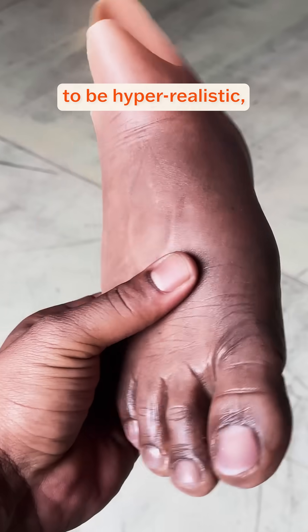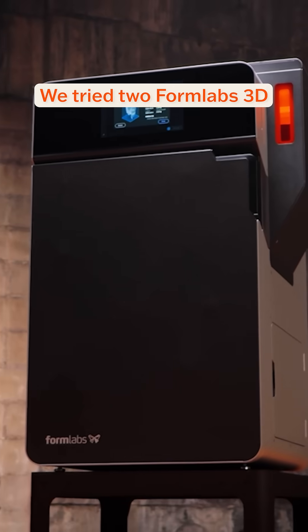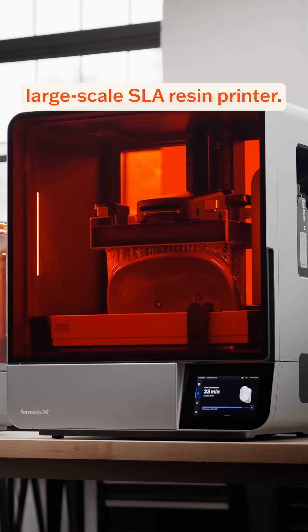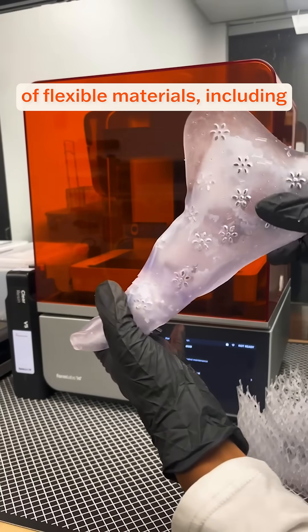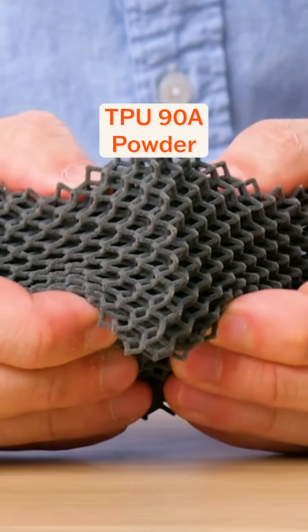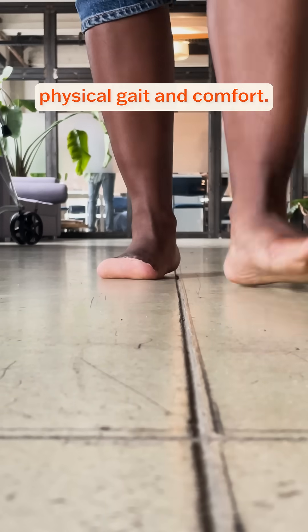Her previous prosthesis was designed to be hyper-realistic but was too rigid and uncomfortable. We tried two Formlabs 3D printing technologies: the Fuse 1 Plus 30W SLS powder-based printer and the Form 4BL large-scale SLA resin printer. We tested a range of flexible materials including Silicone 40A resin, Biomed Elastic 50A resin, Biomed Flex 80A resin, and TPU 90A powder to determine which would provide the best support for Sydney's physical gait and comfort.